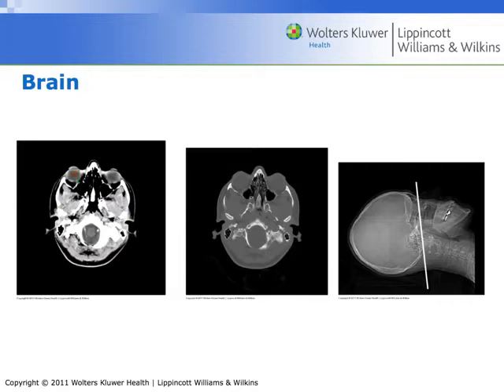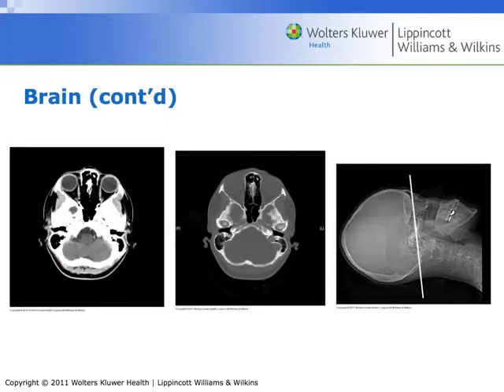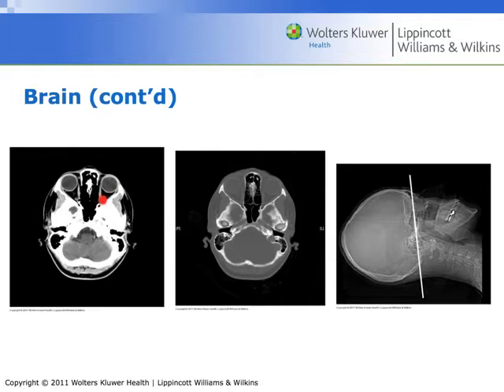Eye. Ethmoid sinus. The medial rectus muscle. The globe of the eye. This little line right here is the optic nerve. Sphenoid bone.